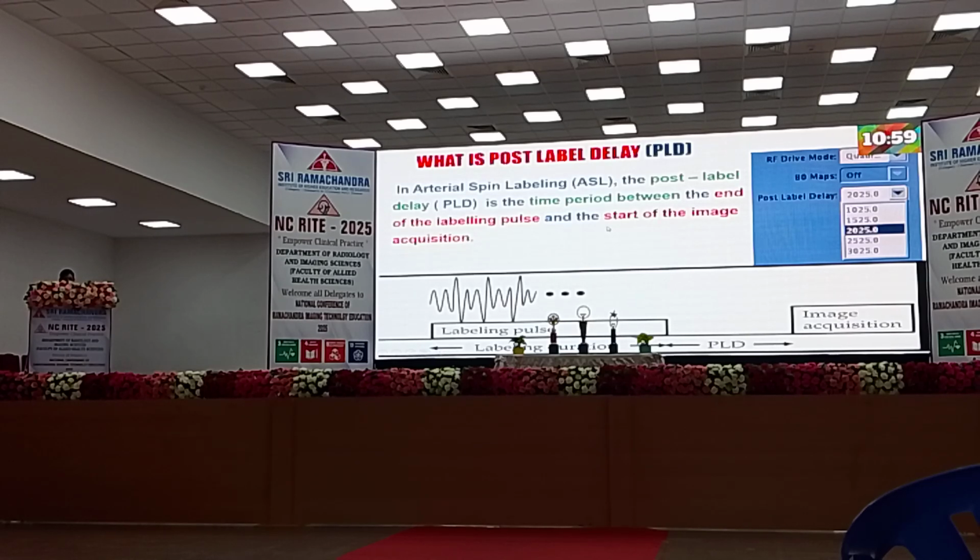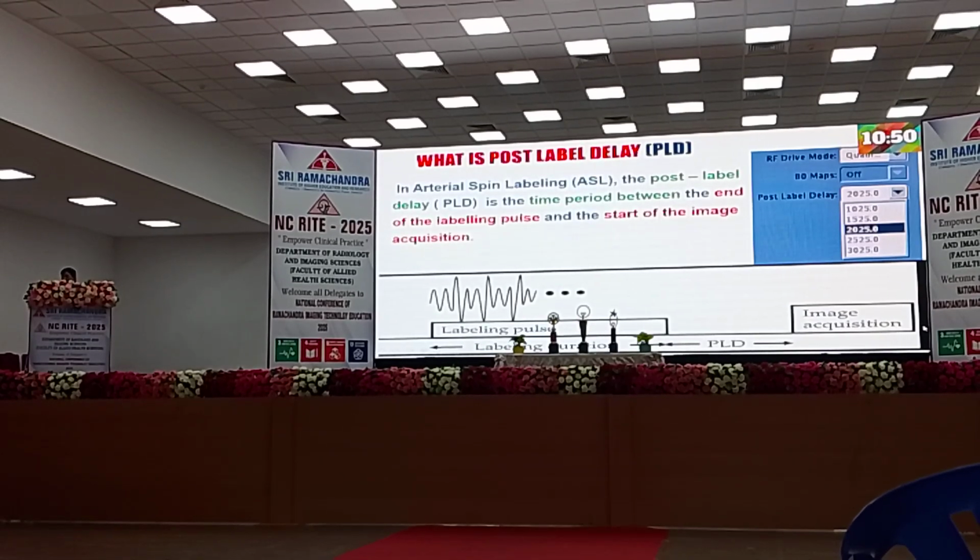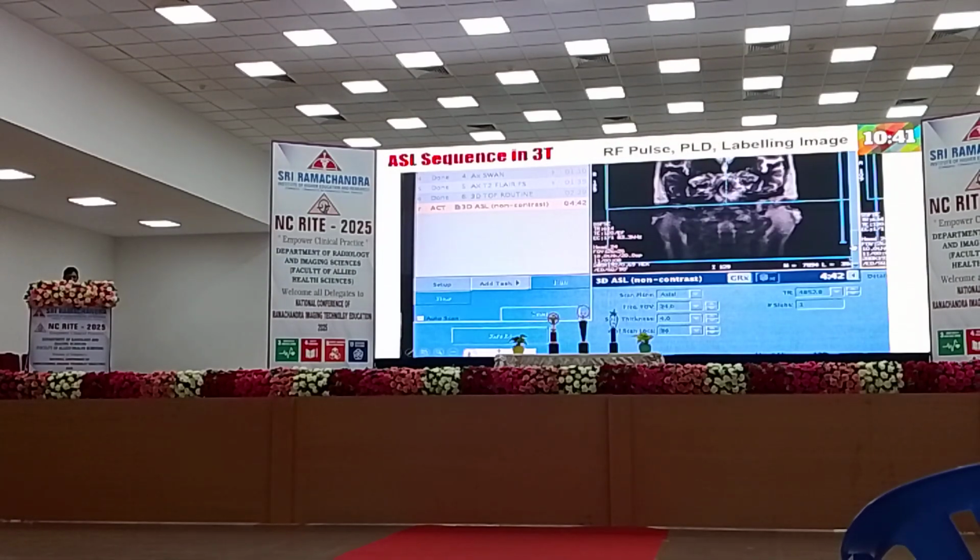PLD is the time period between the end of the labeling pulse and the start of the acquisition time. So that is the PLD. You can see here that a lot of PLD parameters are there. It depends on the patients and conditions, you have to change the PLD. So this is the sequence we are using with a PLD.